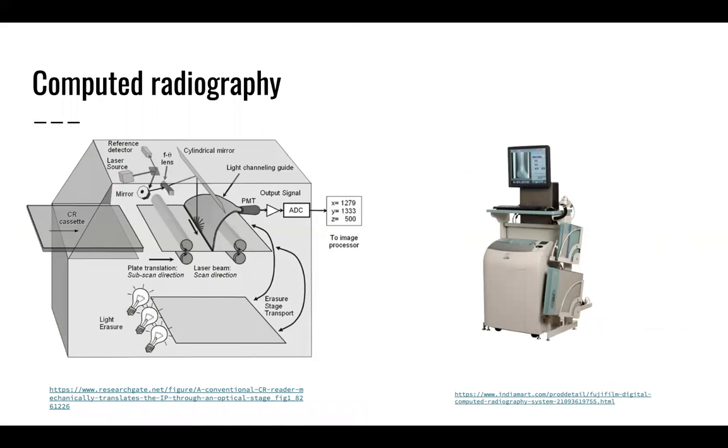This is computed radiography. So on the left side, there's an image of what the machine looks like on the inside. And then on the right side, it shows what it looks like on the outside, so what it looks like when we see it in a clinical setting.